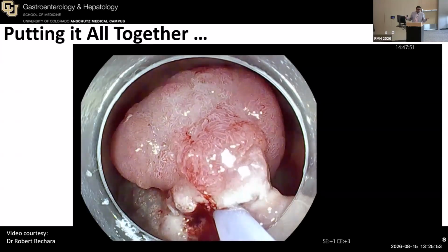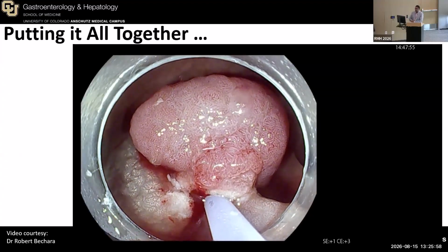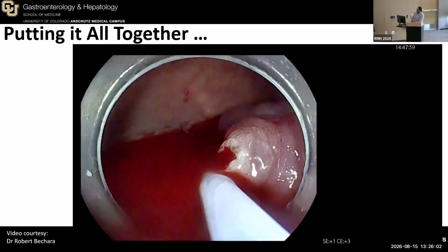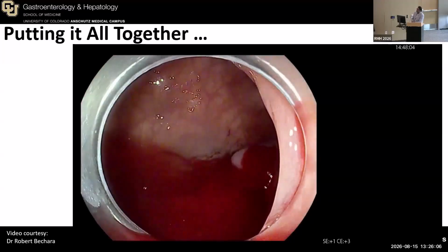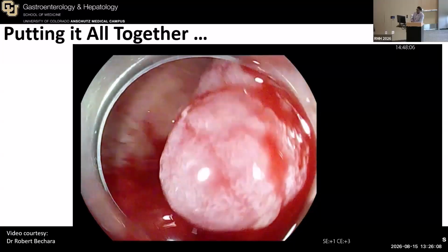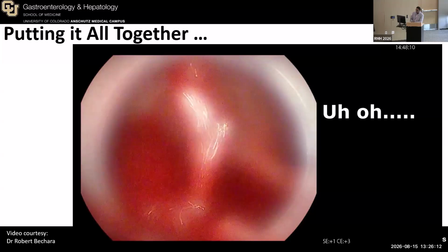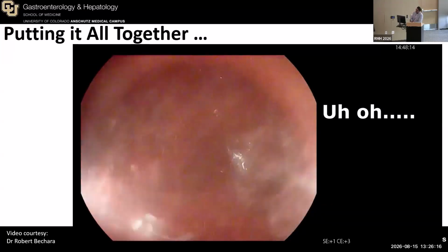So everybody who's done endoscopy, every nurse who's done endoscopies, removes this run-of-the-mill pedunculated polyp in the sigmoid. You put a hot snare around it, and once you put a snare around this polyp, all of a sudden you start having bleeding. So you see bleeding in this case, and it's hard to visualize where the blood is coming from. The patient's heart rate is going up, but my heart is going up even higher. This is obviously not my case.